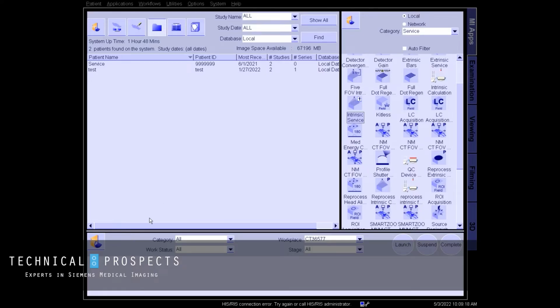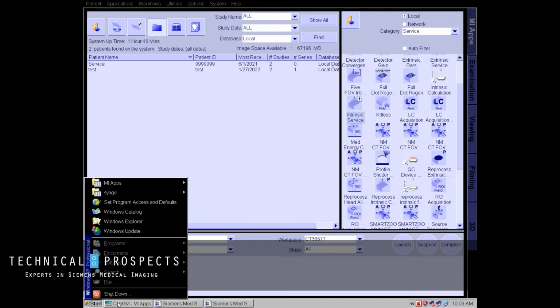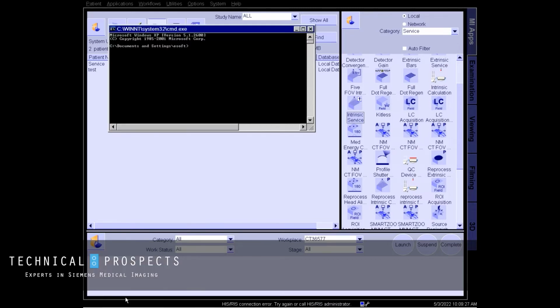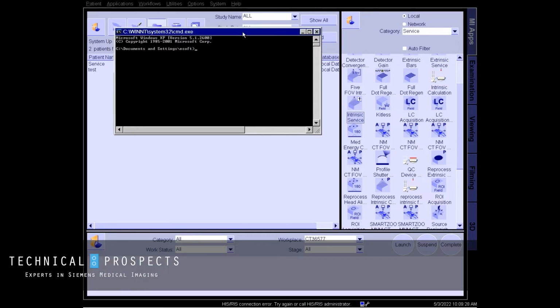Today I'm going to show you how to Telnet into the SNAC as well as ping it to make sure that it's working for a Symbia nuclear medicine camera. To gain access to the Telnet for the SNAC, we're simply going to hit the Windows key, then Run, and then CMD or command code. This will bring us up a command window.